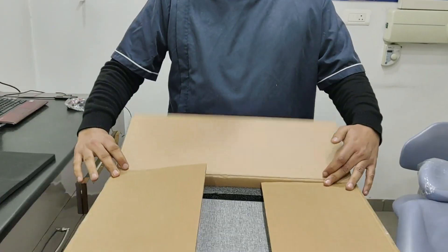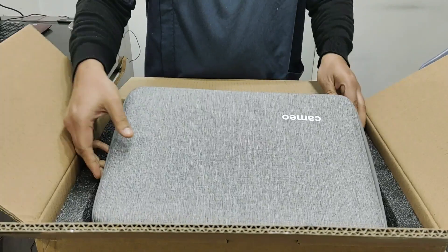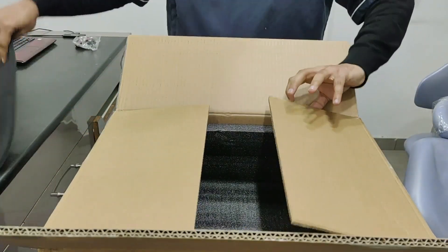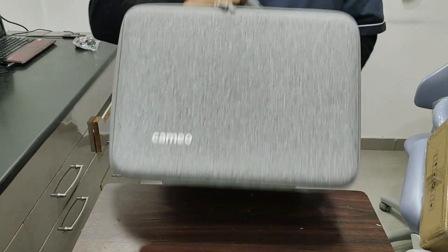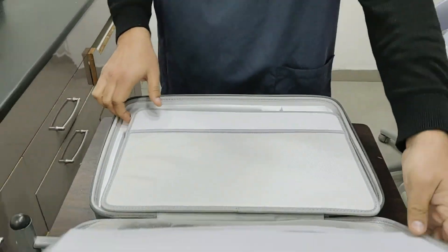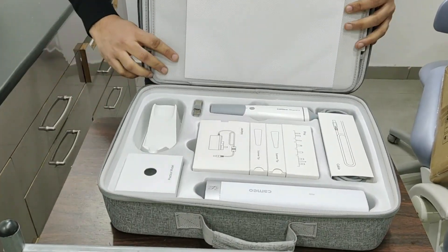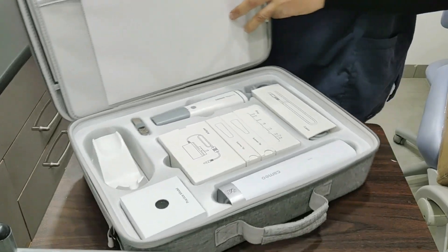This is the package that we got. When we open it, we get this safe packaging. In this, it comes with a travel case. Let's remove it and keep it on the side, and let's keep this carton on the side as well.